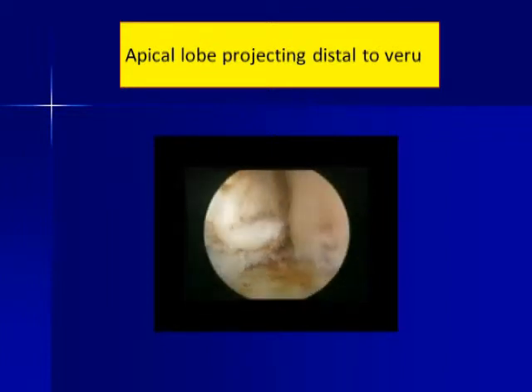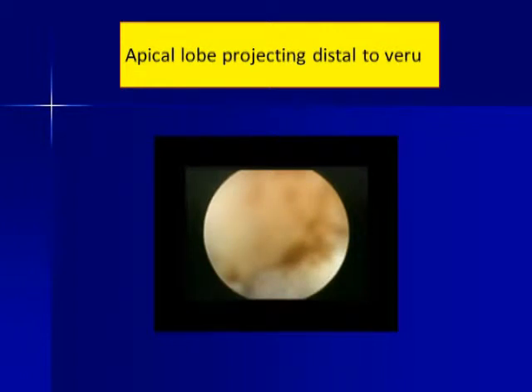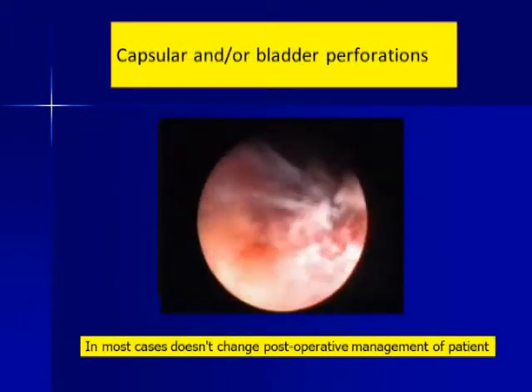I have also done thulium enucleation, and what I found is that it is really difficult to get into a proper plane between the sphincter and the apical tissue because of the charring of the tissue, and doing such amount of distal dissection is really challenging with that laser.